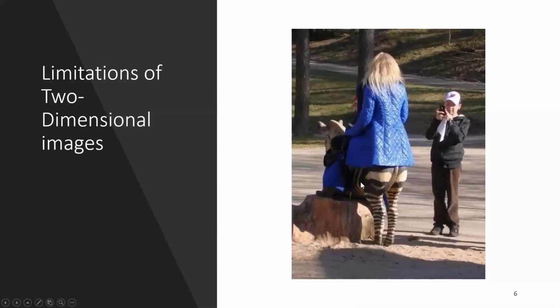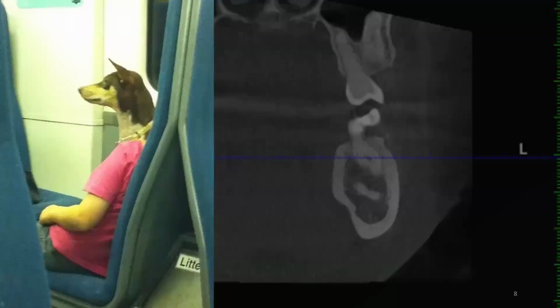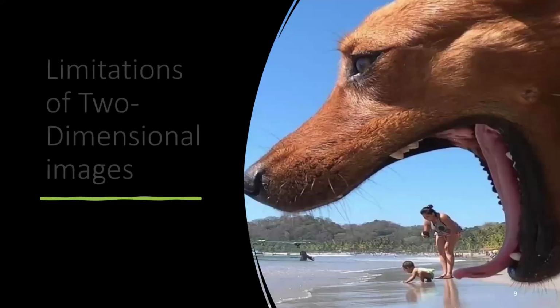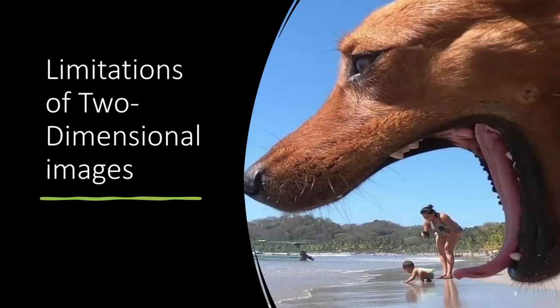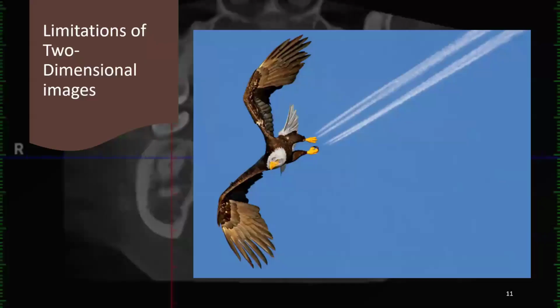So I might have got a little carried away with all these images showing how there are limitations with 2D imaging. This goes for radiography as well as just photography. Certain things tend to overlap each other, and if you're not sure what you're looking at, things can look very strange. Here's a dog eating some people on the beach. That one's interesting. Then I like this one. Go America.